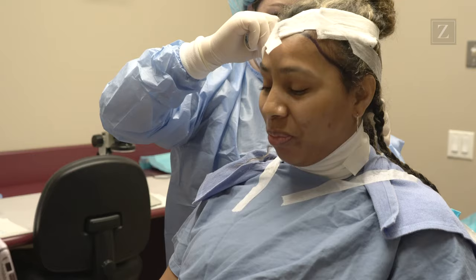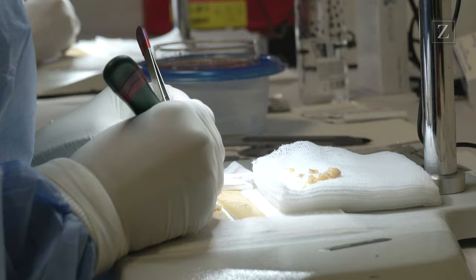It is the standard, the gold standard, because of its remarkable efficiency in harvesting the hair and effectiveness in delivering viable hair into the treatment area. The procedure itself is quite simple.